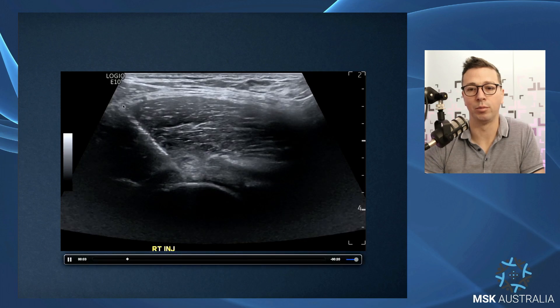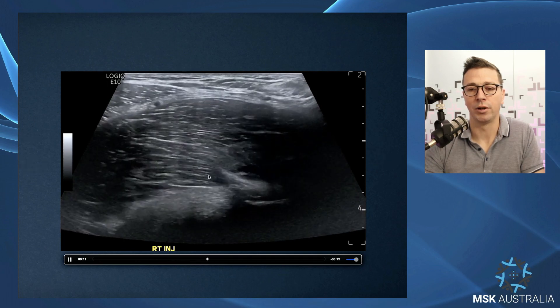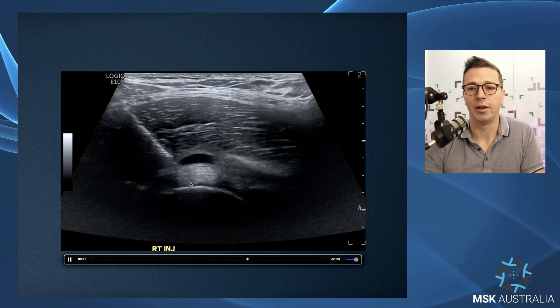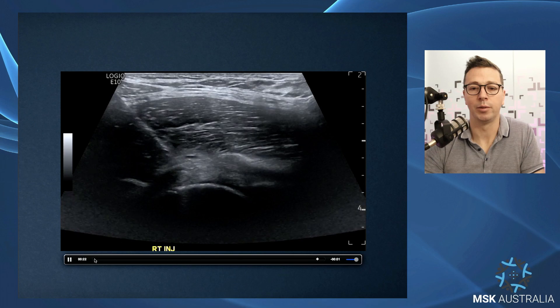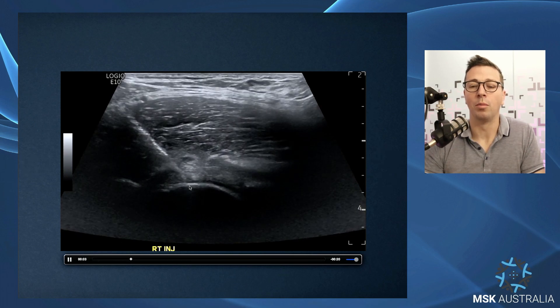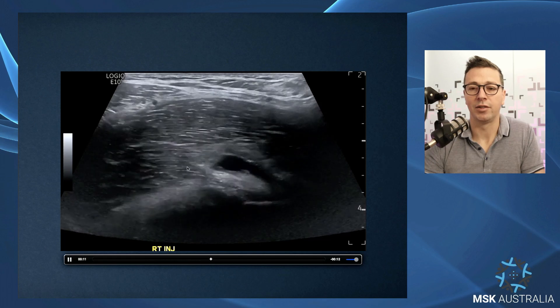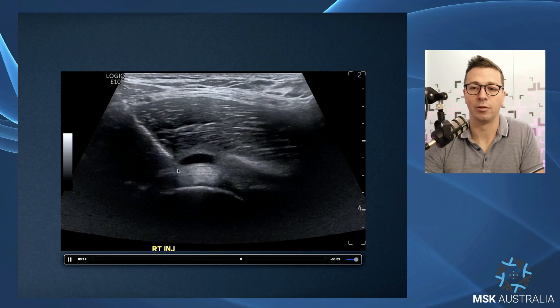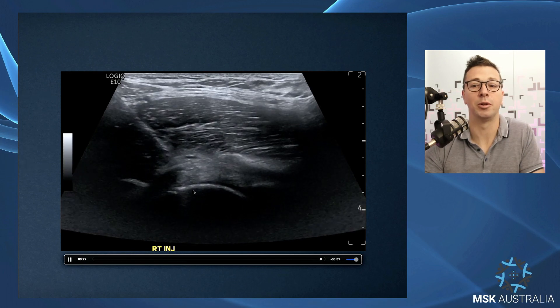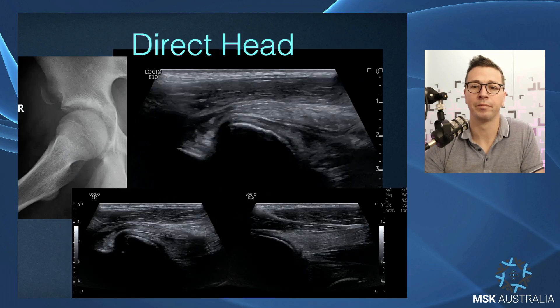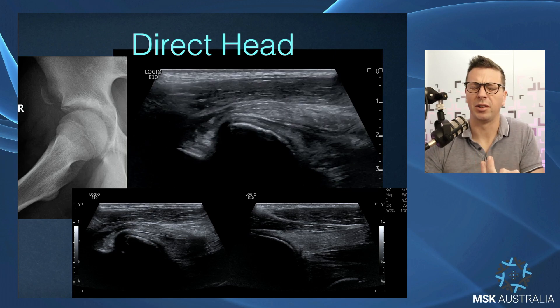Proof that the iliopsoas bursal complex is contiguous with the hip joint: as we drop the needle down under the iliopsoas tendon and inject, even though our bevel was sitting down under the tendon, it fills up and then decompresses into the joint. The bursa can envelop around the tendon, fill up with injectate, and then decompress down into the joint — proving direct communication between the iliopsoas bursa and the anterior hip joint complex.